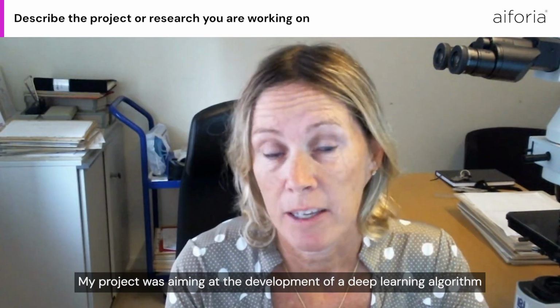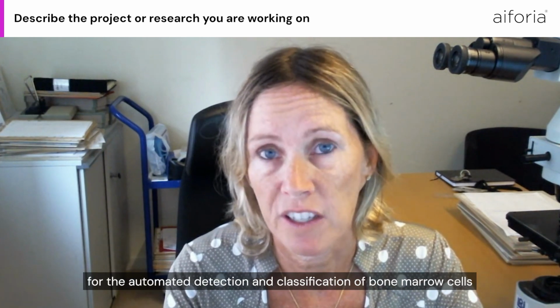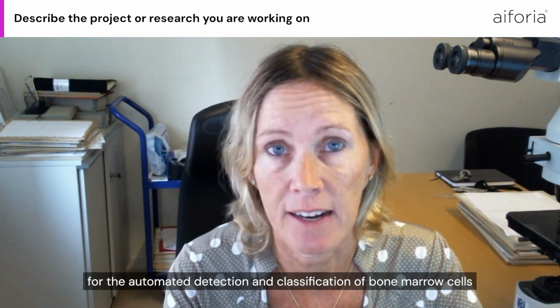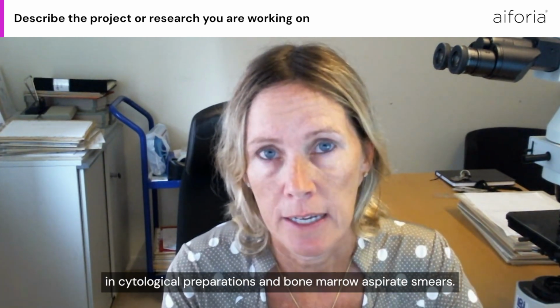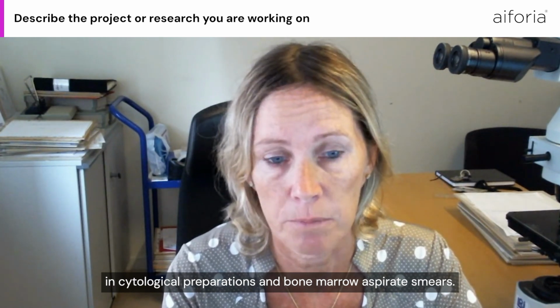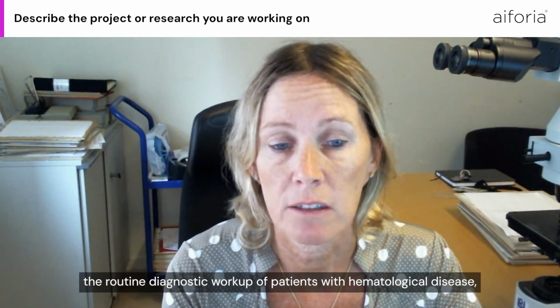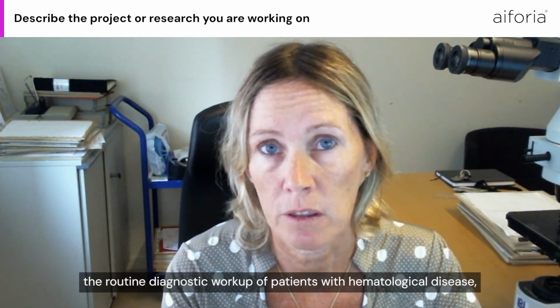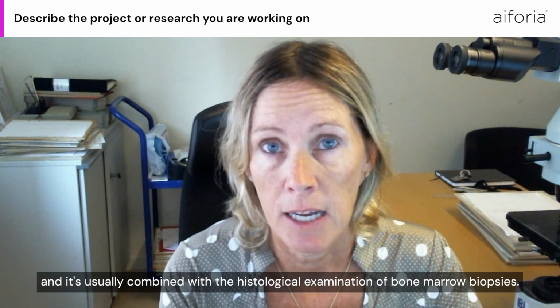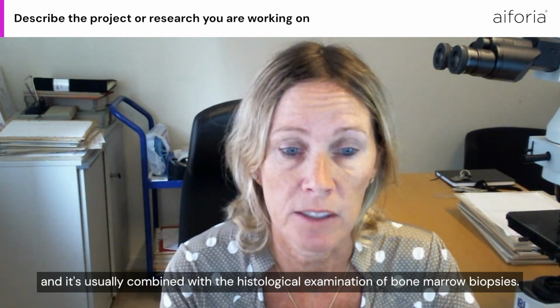My project was aiming at the development of a deep learning algorithm for the automated detection and classification of bone marrow cells in cytological preparations and bone marrow aspirate smears. The assessment of bone marrow aspirate smears is part of the routine diagnostic workup of patients with hematological disease, and it's usually combined with the histological examination of bone marrow biopsies.